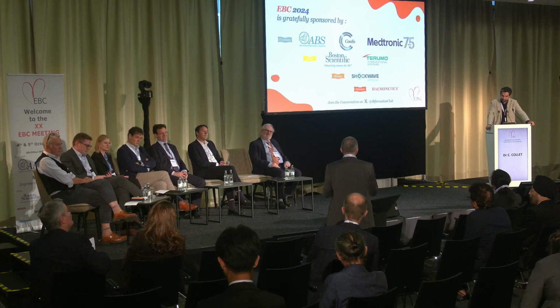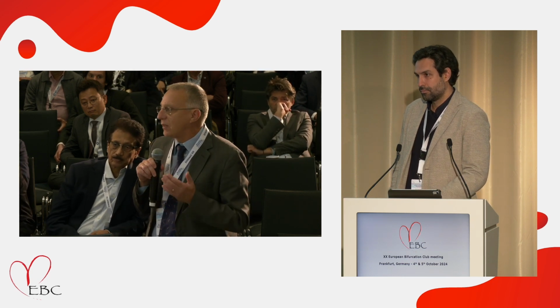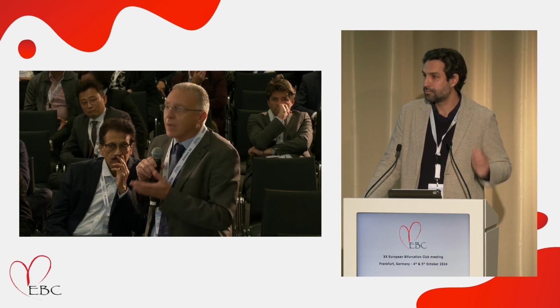This is something that should be the standard, because as a TAVI operator, I learned to use all the fancy devices that allow us to interpret. But if the machine doesn't work, I will never implant a TAVI without having a look at the DICOM file. And it takes really a few seconds to have at least the main information we cannot miss today. So this is a call for action for each of us. Let's start seeing the images, because in the end, we will be better at selecting the best software that will be proposed to us according to our knowledge.